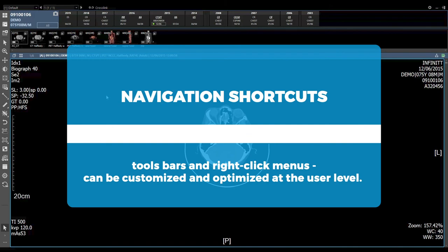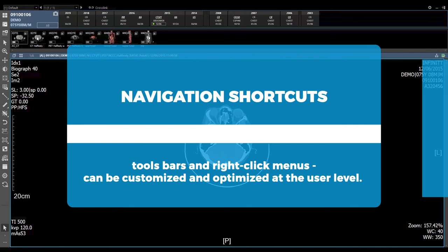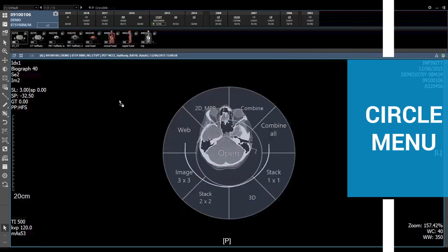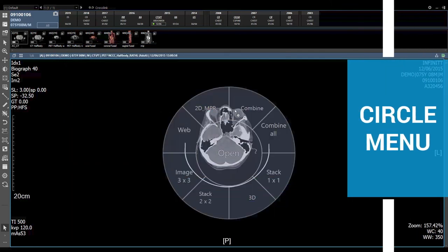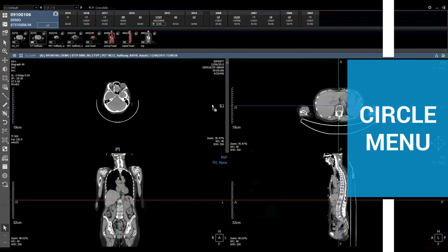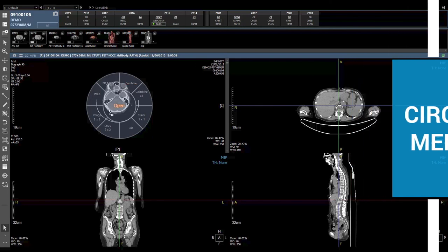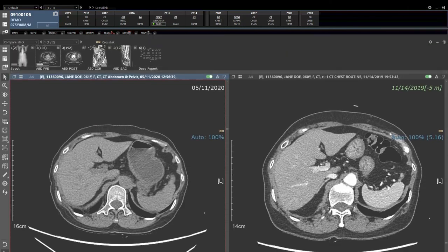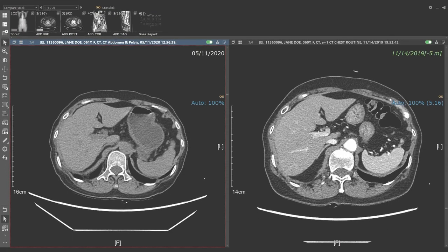Navigation shortcuts, toolbars, and right-click menus can be customized and optimized at the user level. An advanced tool called Circle Menu allows you to apply frequently used layouts and view modes by simply dragging and dropping images onto the appropriate position on the viewer.